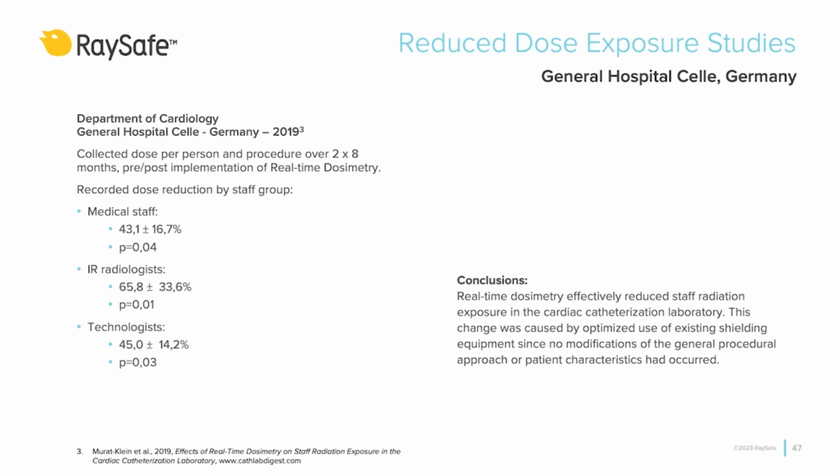In this third German study, a total of 270 coronary procedures were performed in one of the 2 cardiac cath labs. All procedures were exclusively performed by experienced cardiologists with at least 500 cases as a first operator. No educational angiographies or interventionals were included. Importantly, no changes in procedural strategies were allowed in order to prevent changes in dosimetry results not related to optimizing shielding and/or staff behavior.